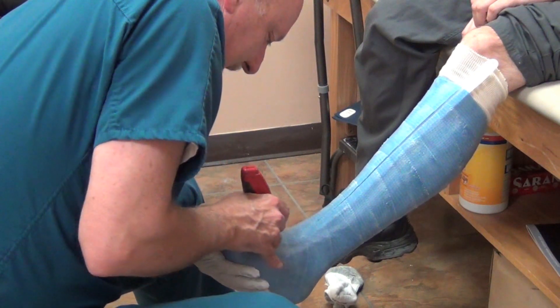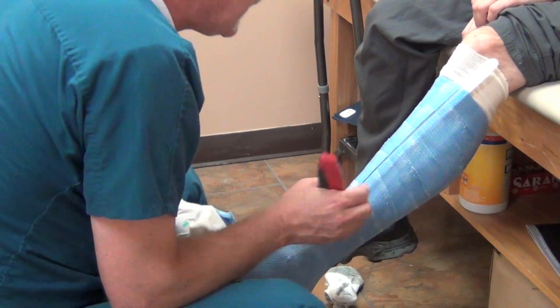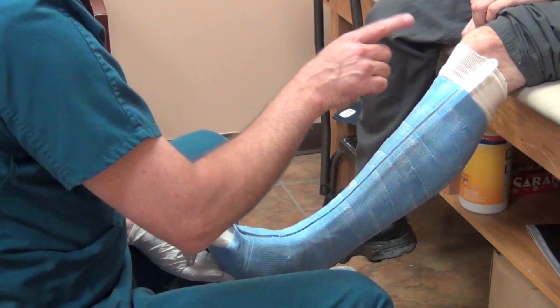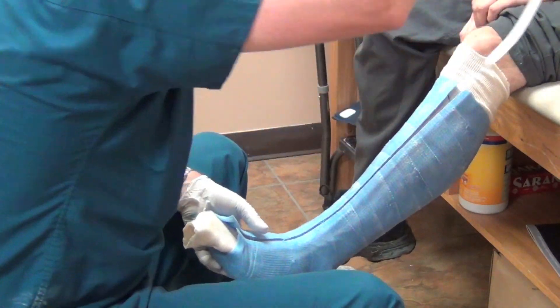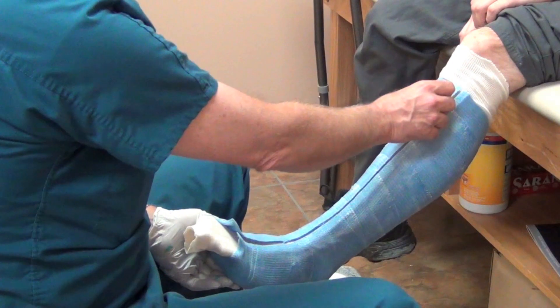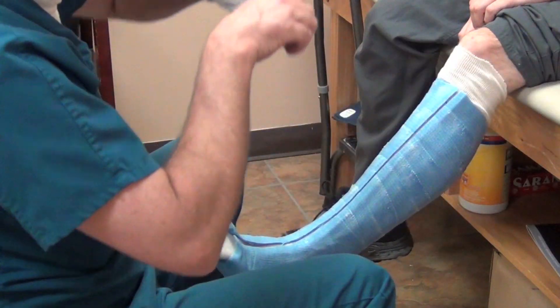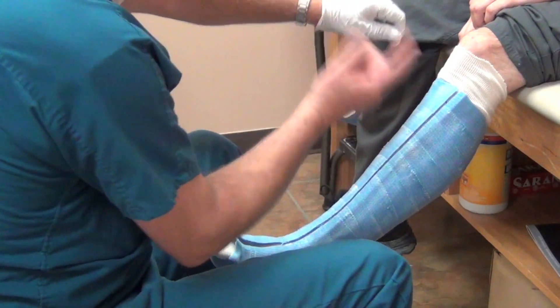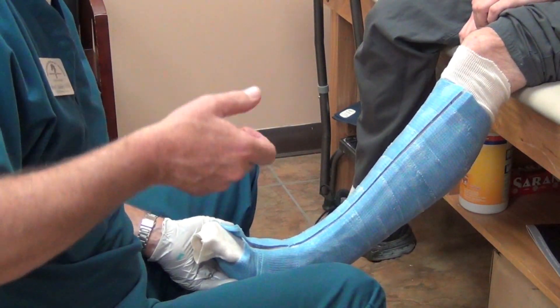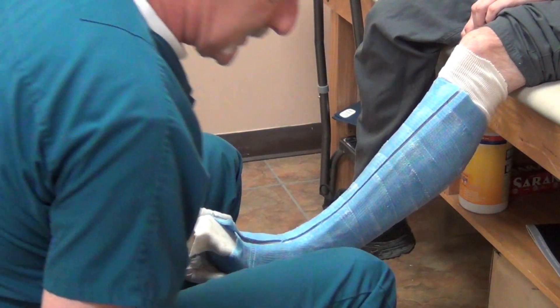This technique is very effective, but you do not have to use it — I've used many techniques. You can use a hook blade with the cascade strip with the raised little bumps on it and cut it off with a hook blade. When I was in El Paso, they used a neat technique: surgical tubing placed along the leg, lubed up with Vaseline, laid on and casted in place. Once it set up, they slid the tube out and used heavy-duty shears to run right through that channel. All of those work just fine.